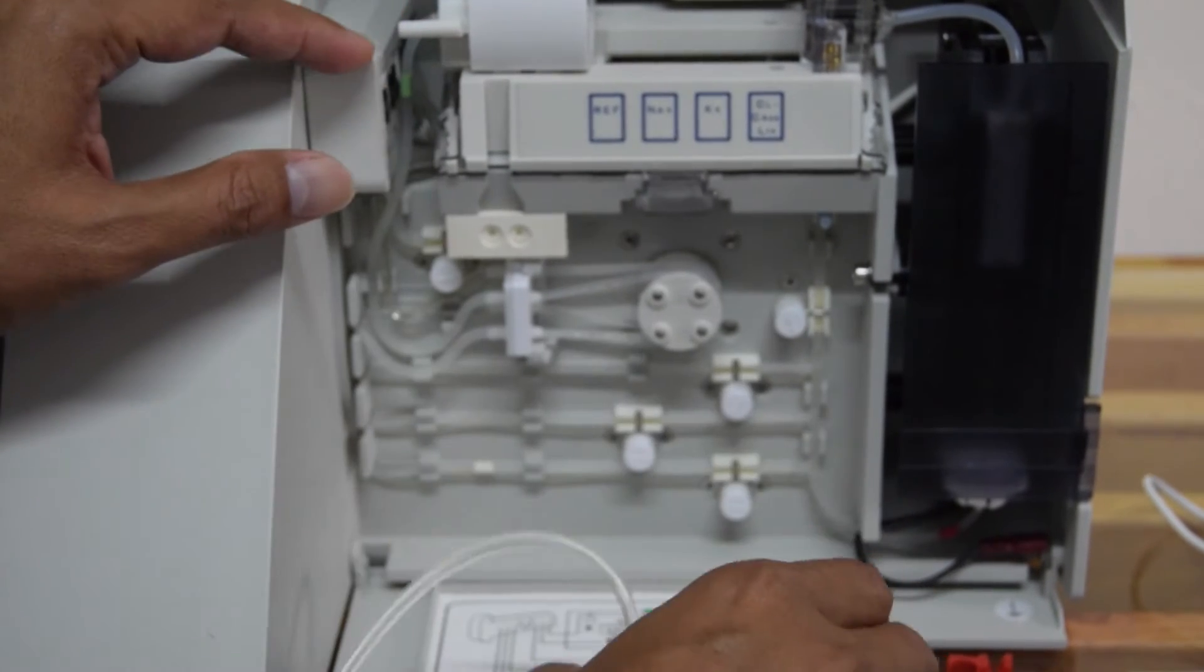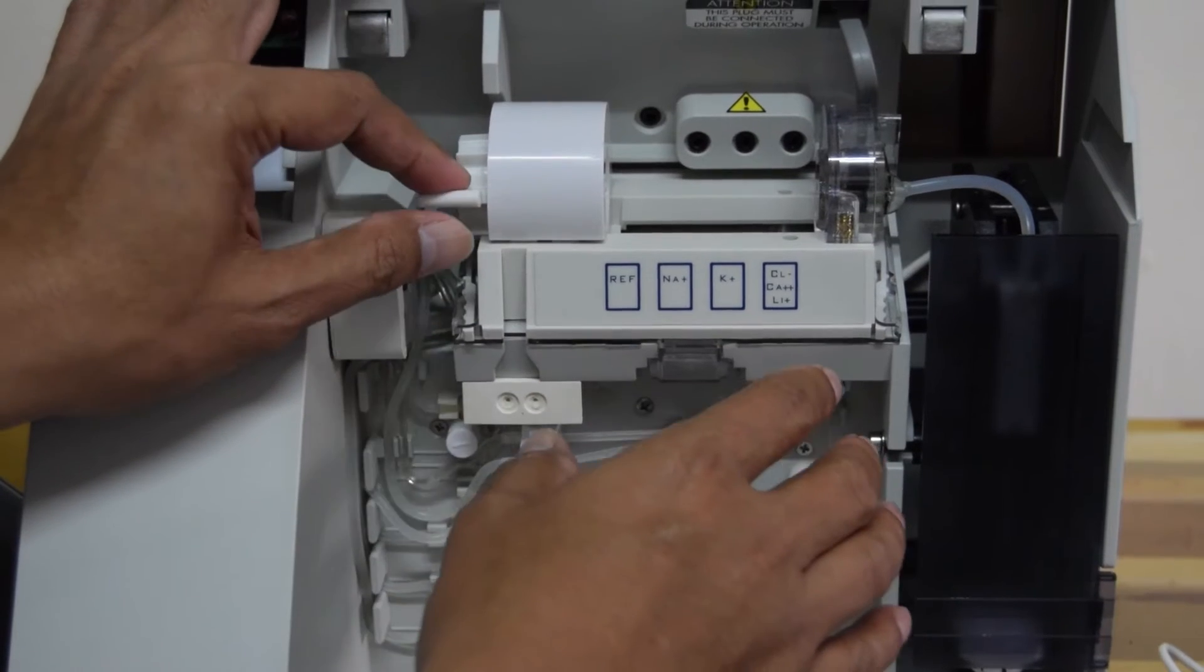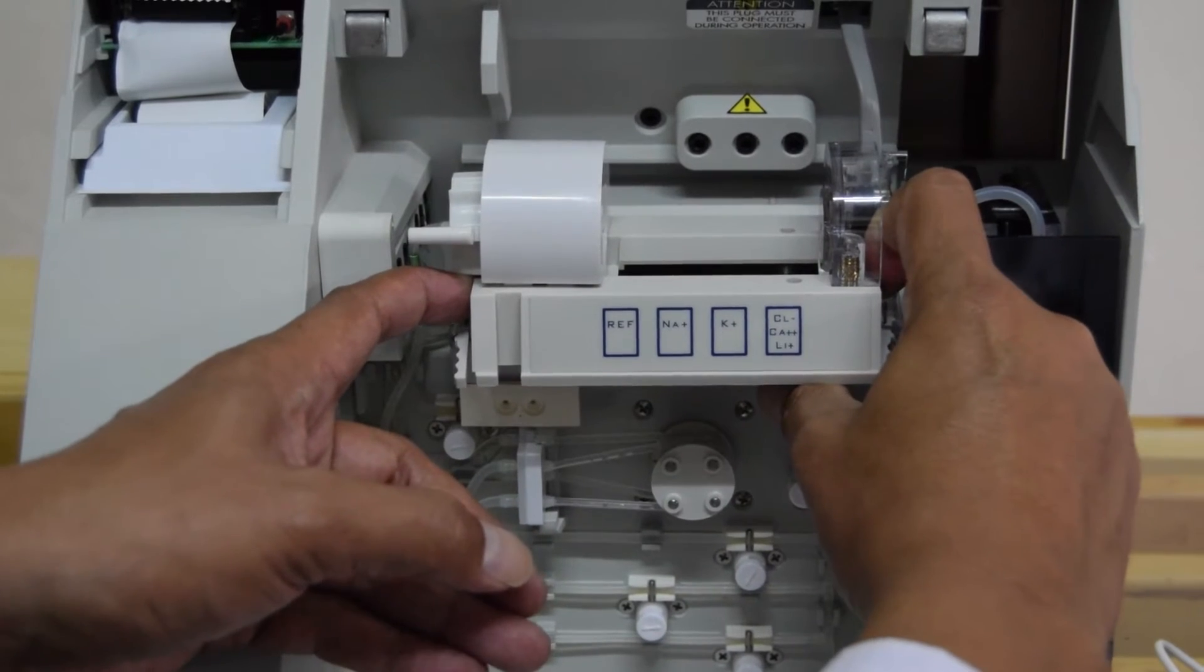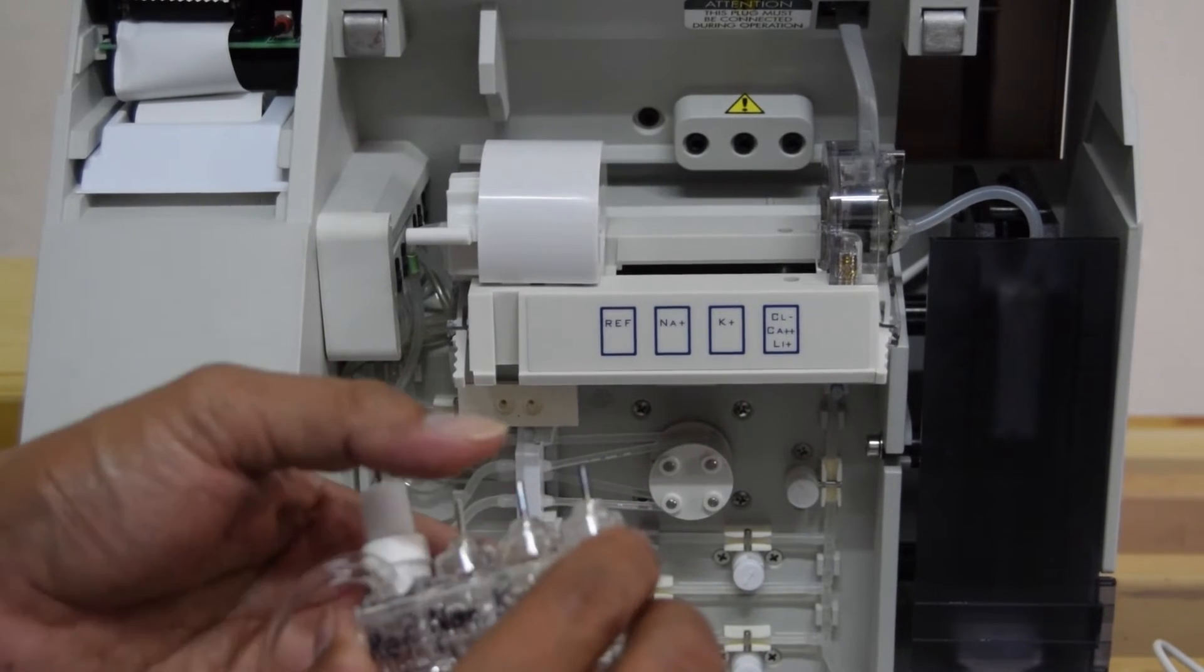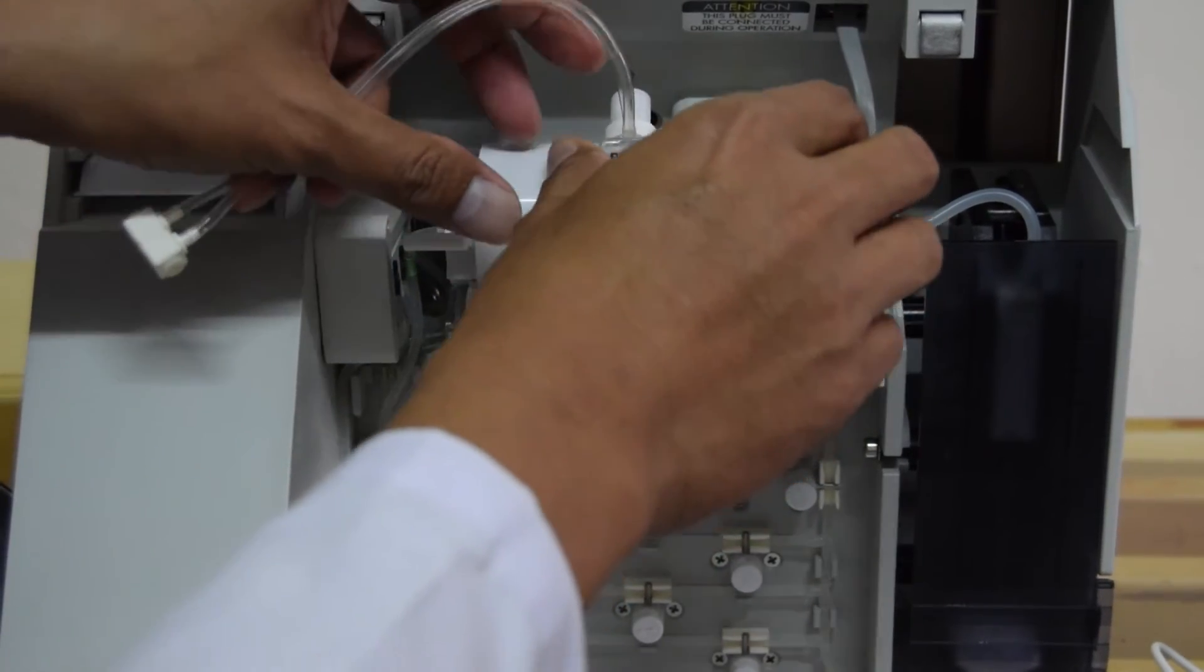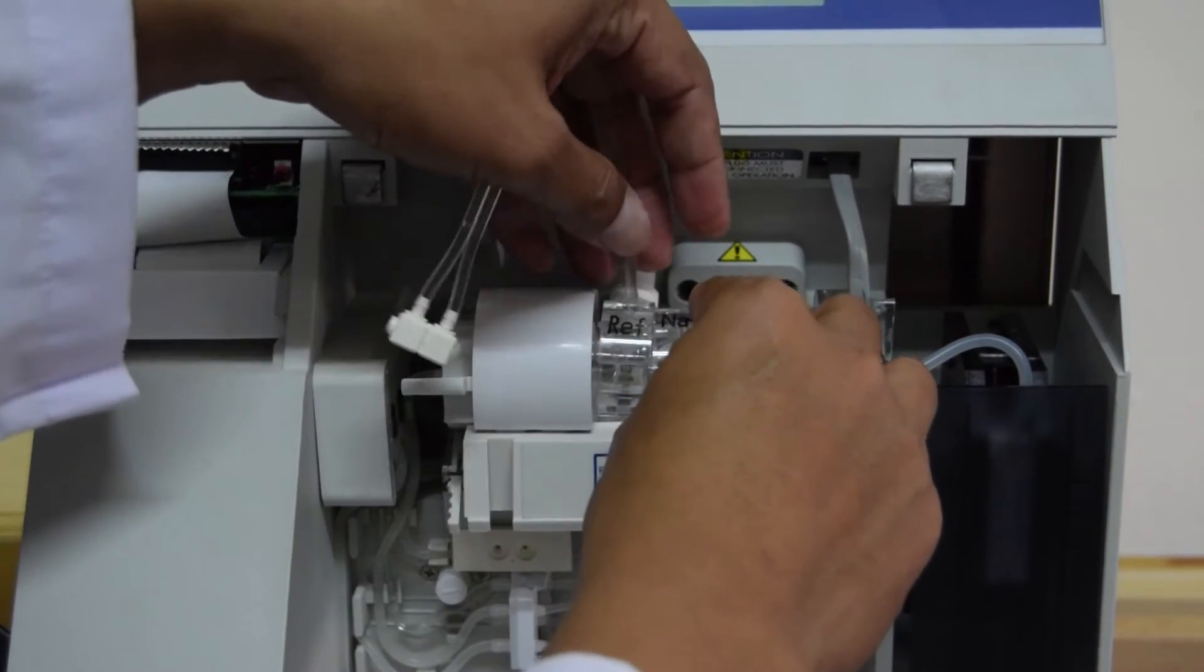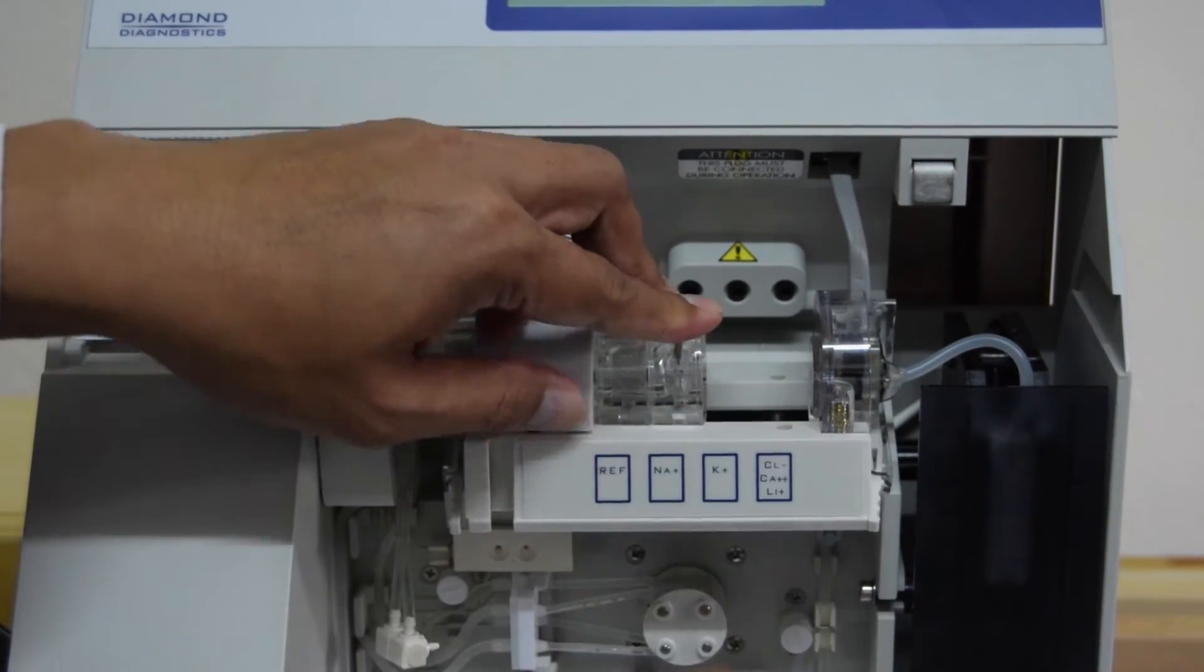Pertama-tama adalah, menarik atau melepas seperti ini. Jepitan dari elektroda tray ini. Terus dilanjutkan dengan menarik perlahan. Seperti ini. Dilanjutkan dengan memasang elektroda.